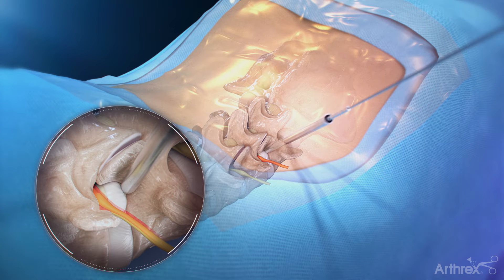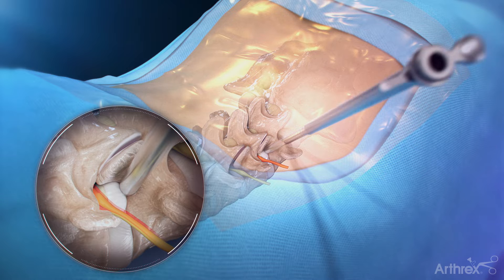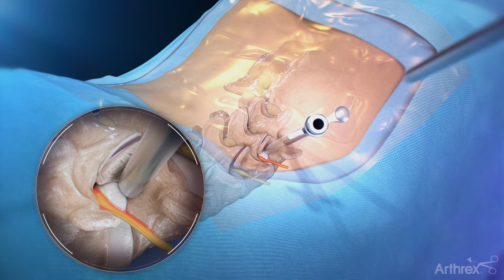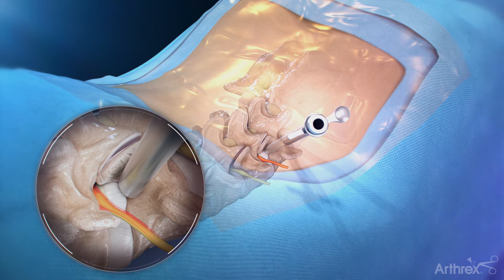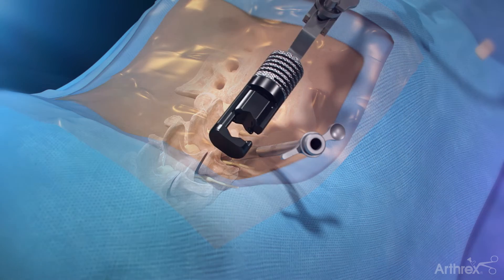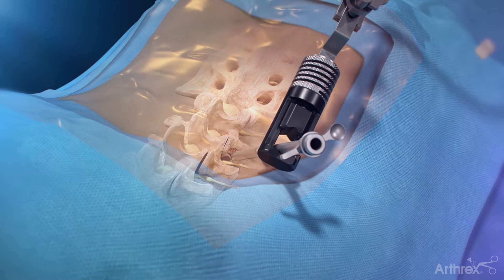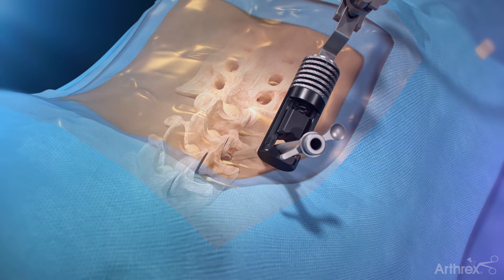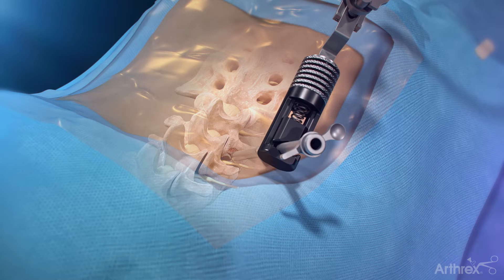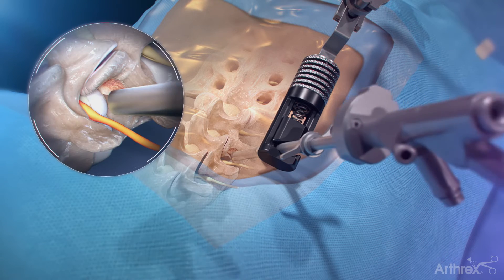Over this needle, dilators are placed to move soft tissue and muscle from harm's way. A cannula is then placed over the dilators to act as a port through which a specialized spine endoscope will be inserted. This system allows for real-time direct visualization of the target region.